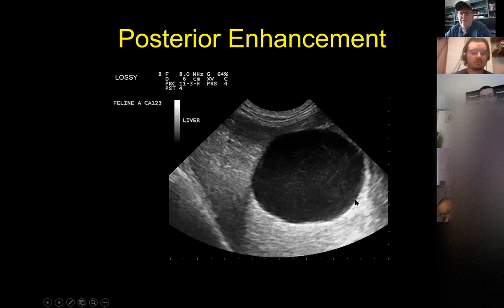Sonographically, a cyst is defined, and if you look at this picture, you'll remember it, as something that is well-defined, thin-walled, and filled with anechoic fluid that demonstrates posterior enhancement. That's a cyst. And what do we know about cysts in the body? Almost every time, cysts are benign. Okay, so posterior enhancement is the opposite of posterior shadowing, and it helps us to define a cyst. Got it?